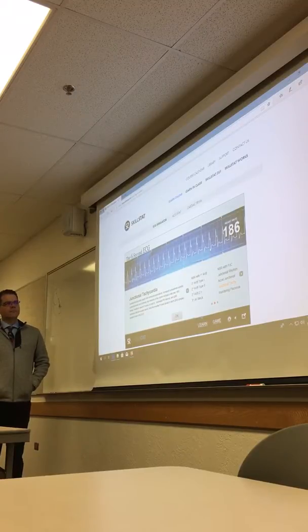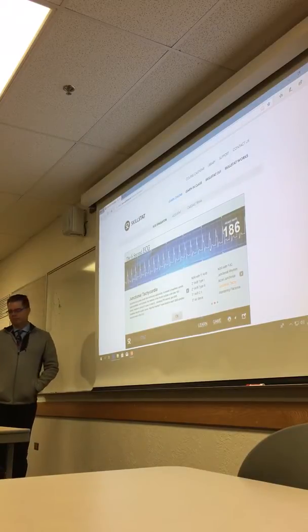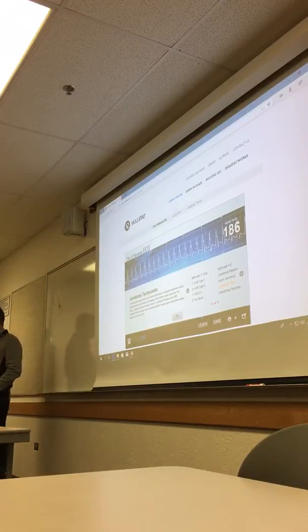Yeah. So when you're studying some of these and you're reading it, you want to know what it looks like. This is one version of it. It's fun to go to Google and put in junctional tachycardia, and now you get to see 20 different junctionals and what they all look like, and you can pick out the characteristics of that.